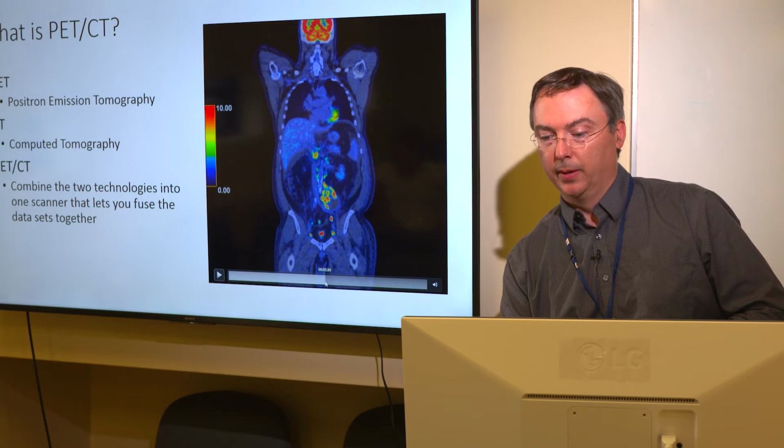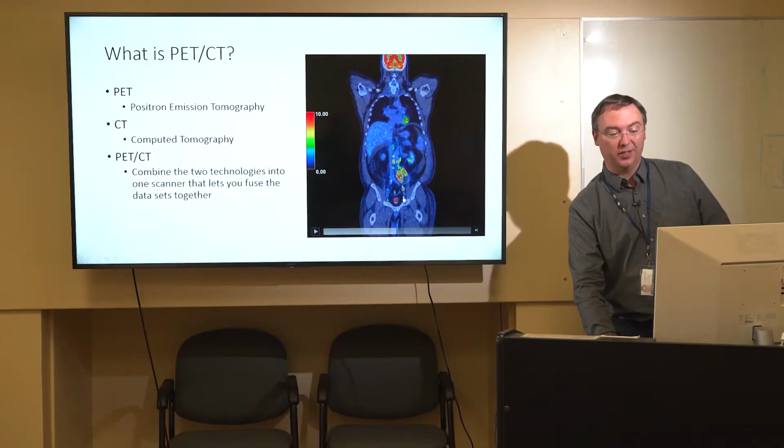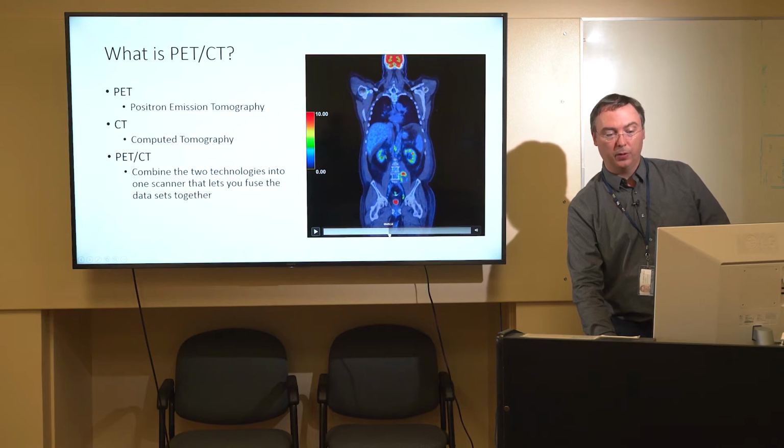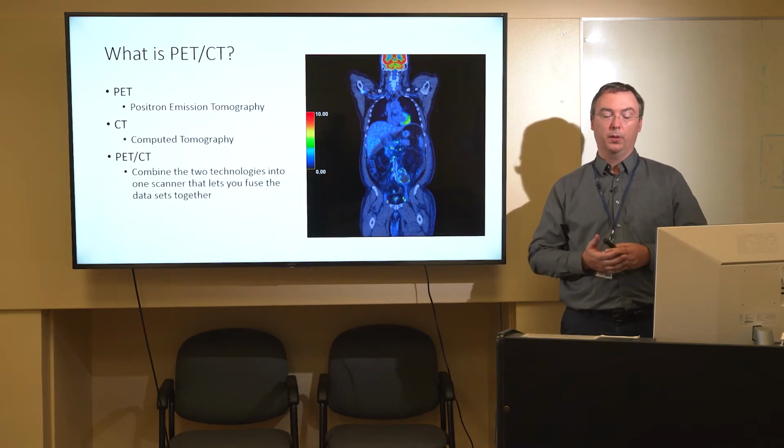And unfortunately, we can also see that some of those little funny gray spots that we saw in the patient's pelvis, they're actually spots of disease. So they're places where the cancer has actually spread to. So that's really, really important for the doctors to know when they're treating the patient, because you do things differently if the cancer is localized to one site than if it started to spread through the body.